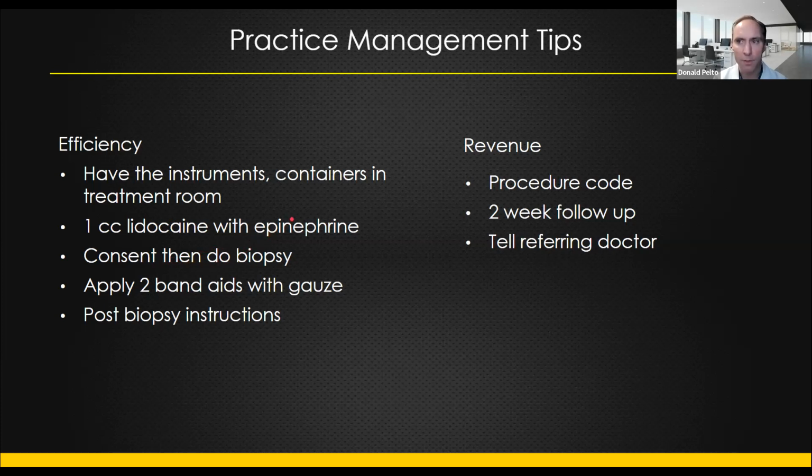And so I'll do that, and I'll usually numb it up with the 1 cc, and then usually literally 5 seconds later, it's ready with the epi. Even if it's in the toes, I'm okay doing it in the toes for the epi. I'm okay with that. I use 2 Band-Aids with gauze. So gauze, 2 Band-Aids, and I give them post-biopsy instructions, and I'll share those with you so you can make your own. I do the procedure codes. So I do 2 2 millimeter punches.